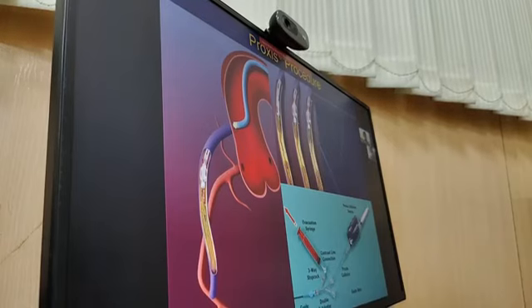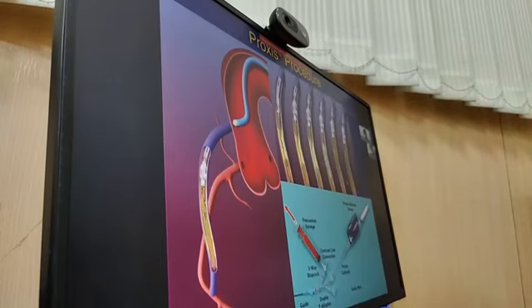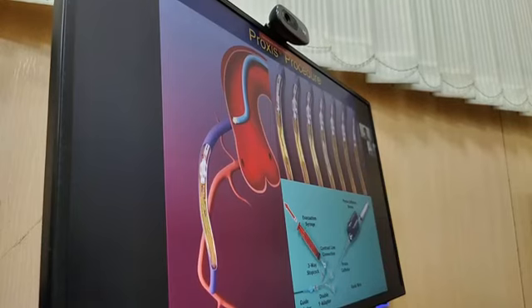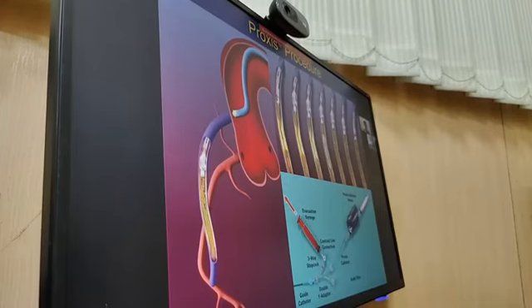So you have to do stenting. There is no blood flow here, and when there is no blood flow, there is no distal embolization. So you put this device here, you put a stent, and then when you remove it, because there is no blood flow, it is stopping blood flow completely. Therefore, there is no embolization. Before you deflate your balloon, you take a catheter and suck out everything which is there. You take another catheter which is inbuilt, that is part of the system. It comes with the whole device. You mentioned an evacuation device. So you suck out the whole thing so that there is no embolization.